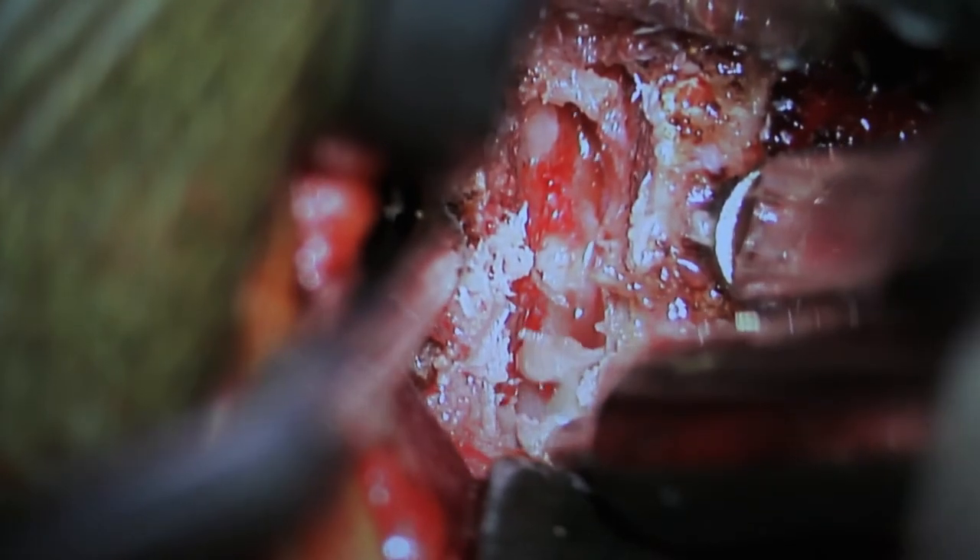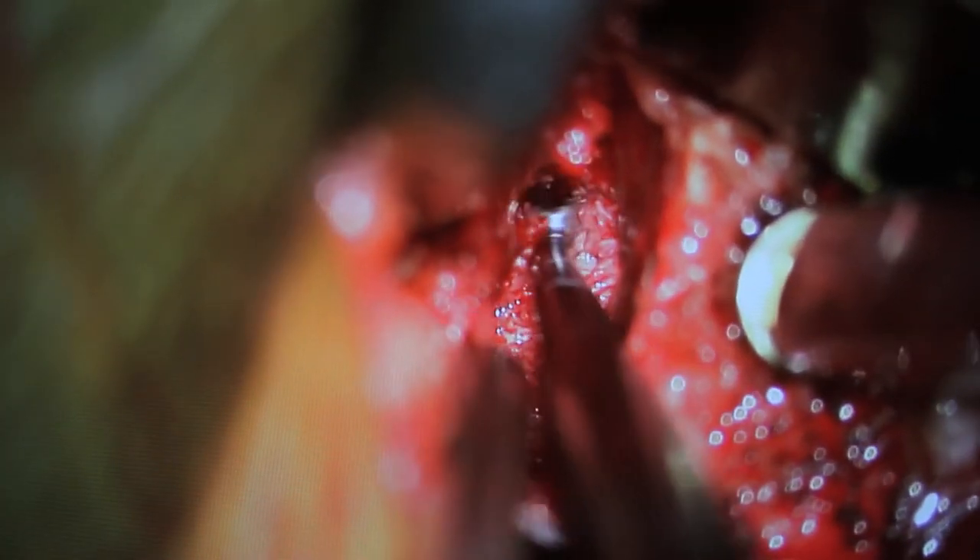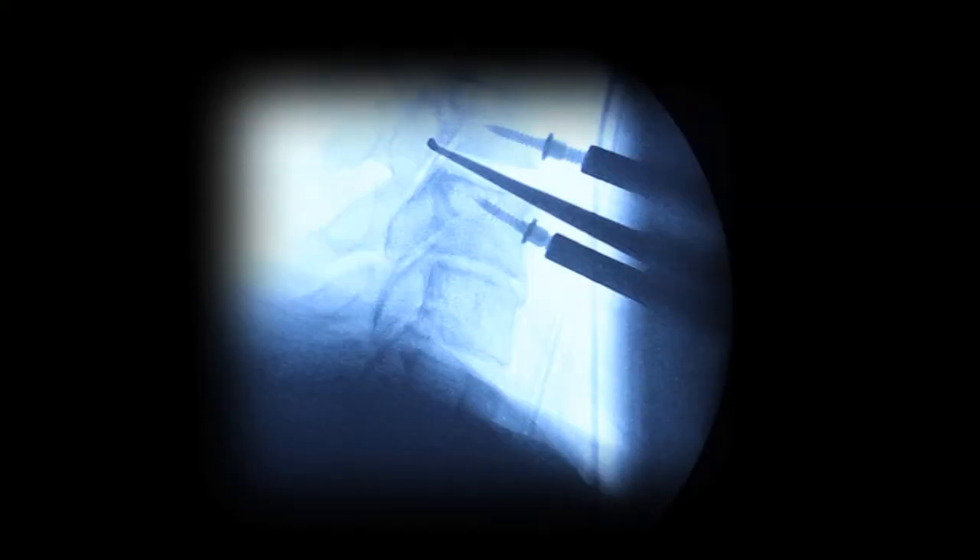Anterior osteophytes are removed with a high-speed drill. The discectomy is completed with a series of curettes and a pituitary rongeur. A small curette can be used to confirm the extent of decompression, which can be viewed under fluoroscopy.